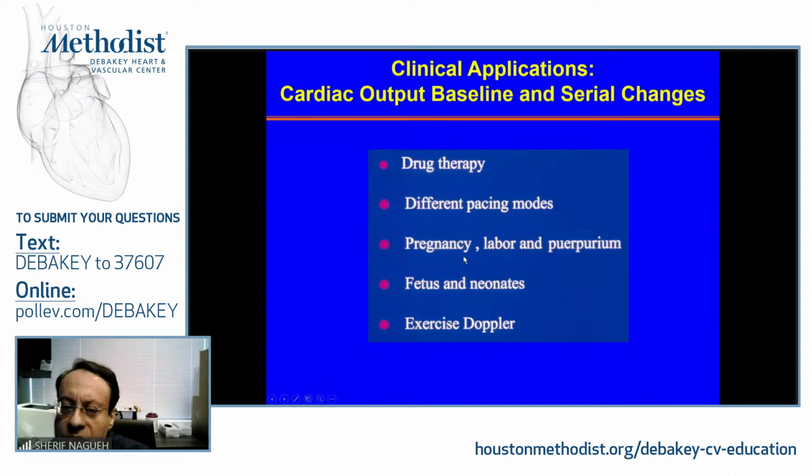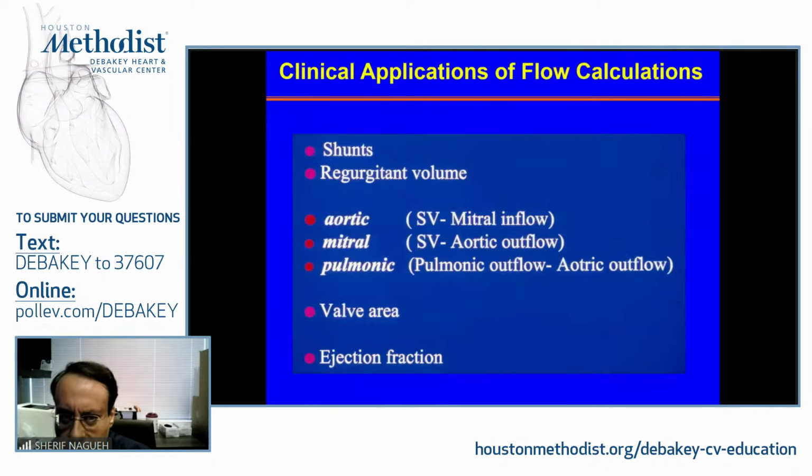What are the changes that happen in cardiac output with physiologic situations? How about cardiac output for fetuses and neonates? And then looking at flows with exercise Doppler. While the principles hold with respect to exercise Doppler, having higher quality data can be more challenging in this setting. Aside from these applications, there are other applications that we rely on flow measurements.